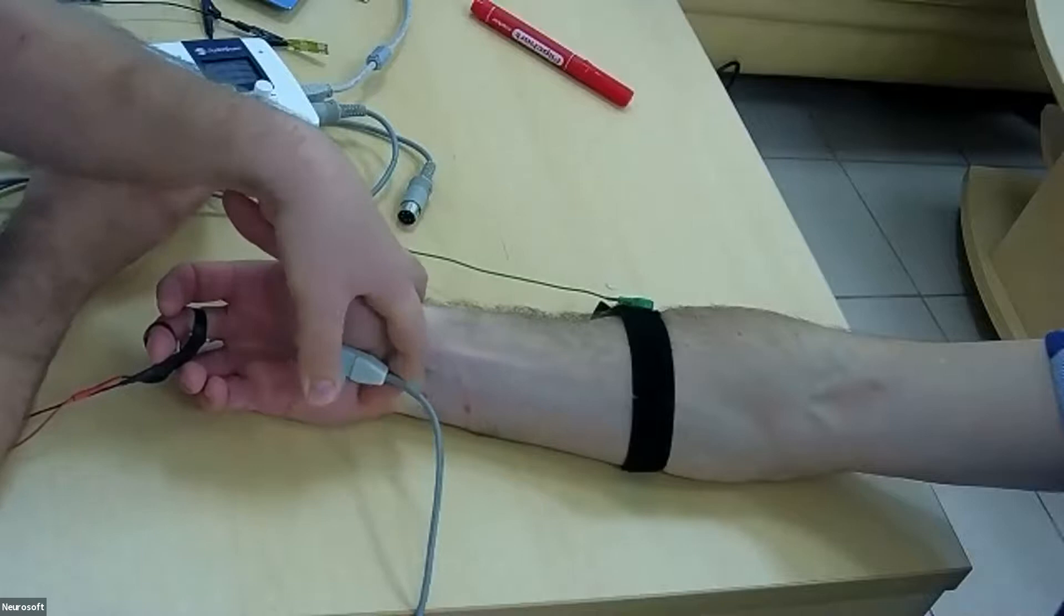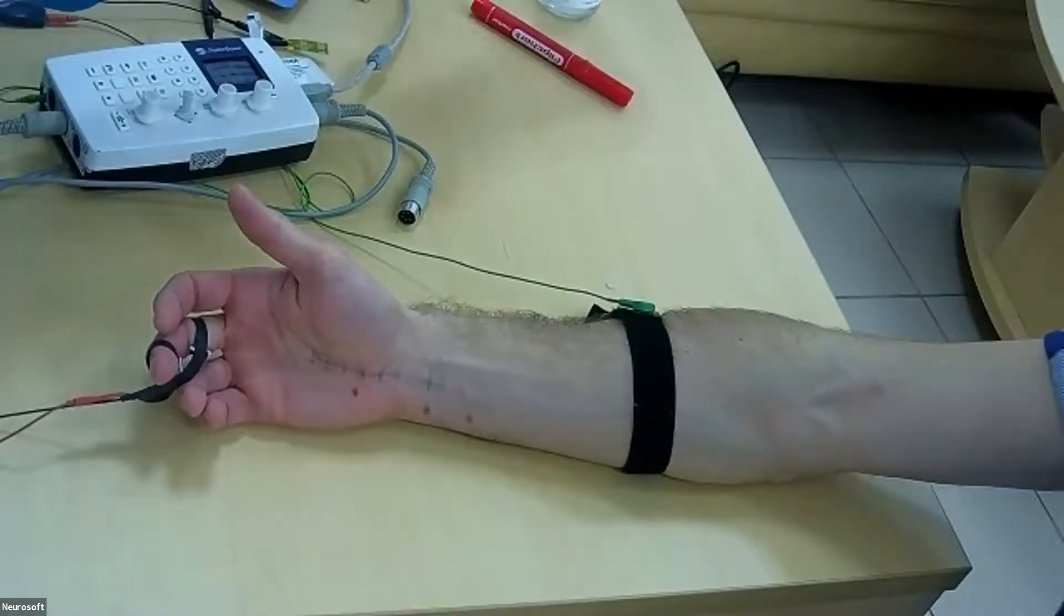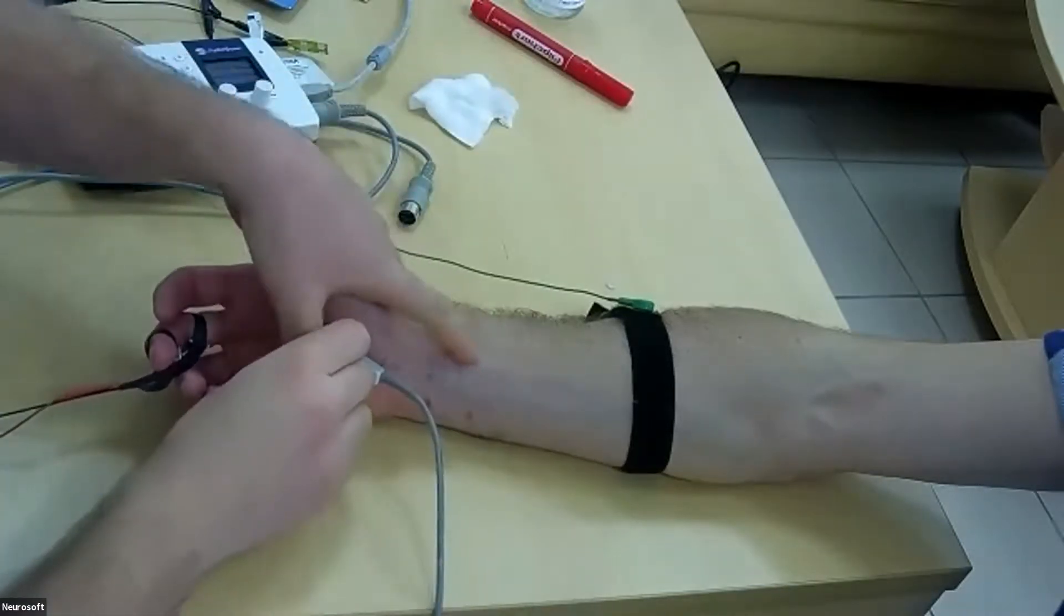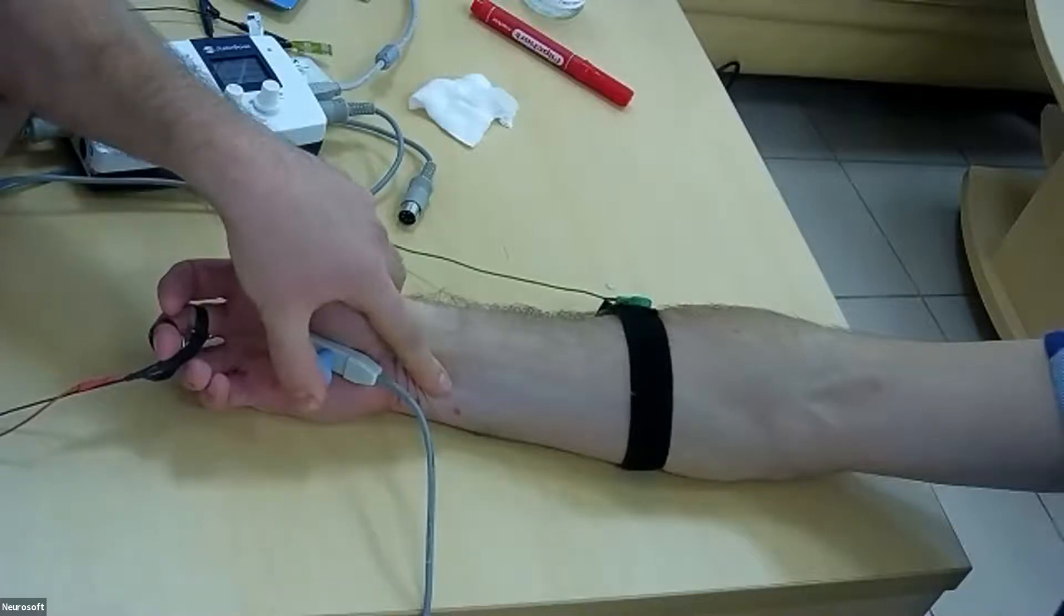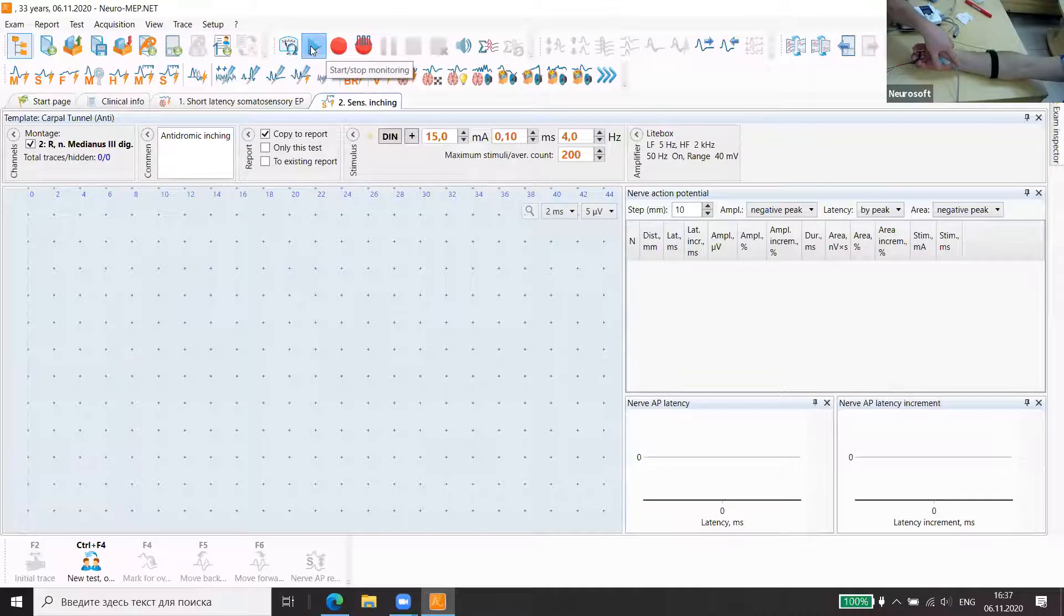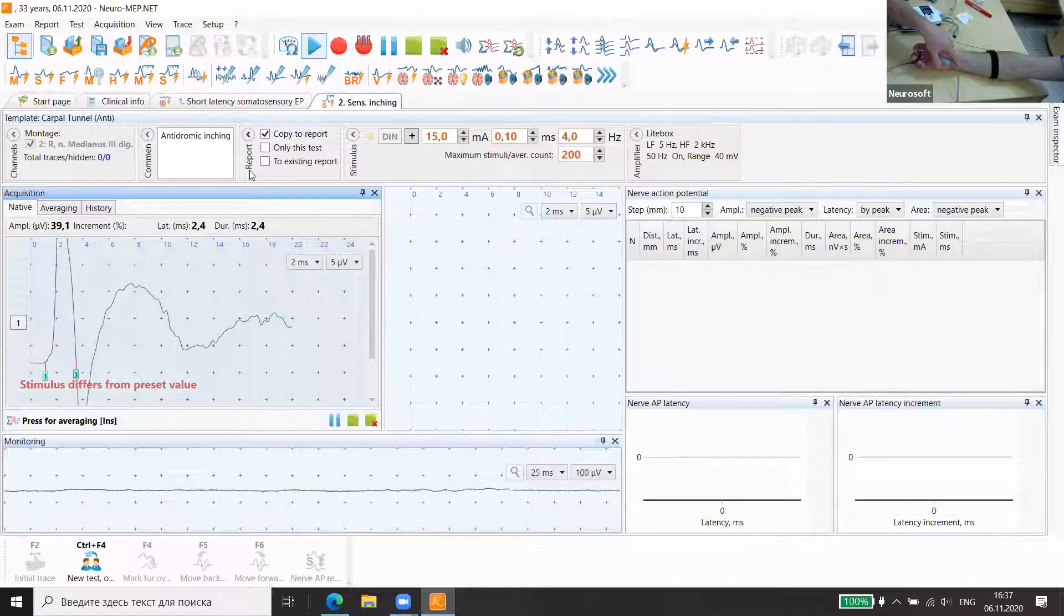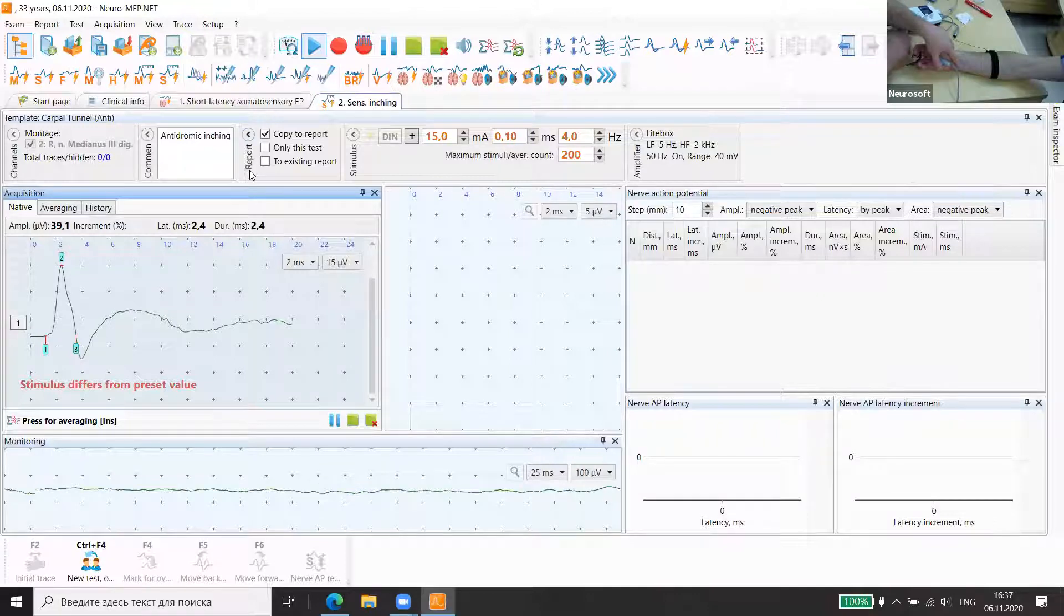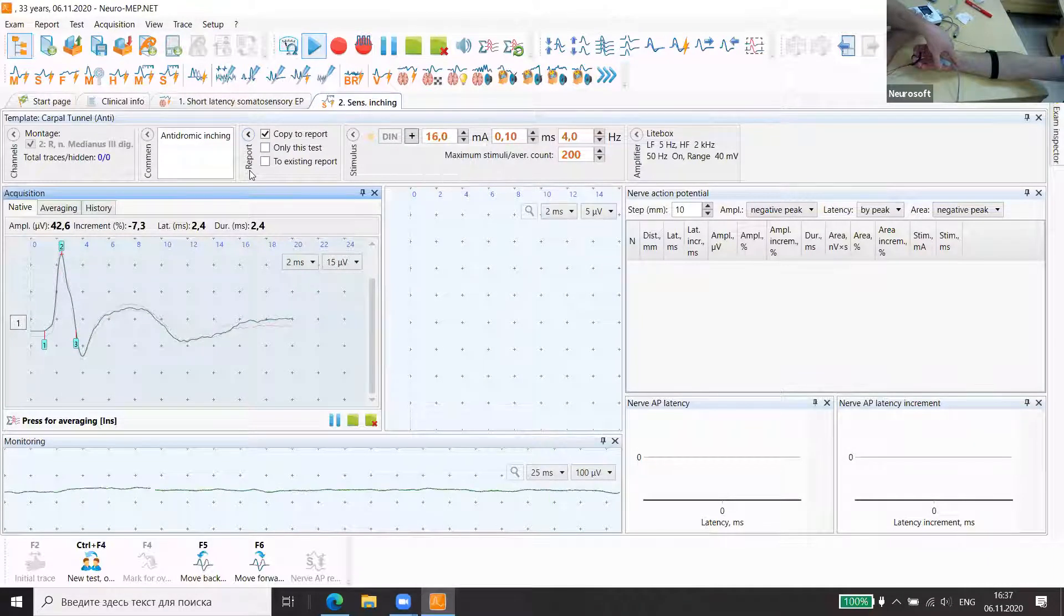We need to get a good answer. I wet the stimulation electrode. The screen demonstration is not activated. Sorry. You can see I gradually increased intensity. Now it was about, we have a very good curve line, so we can start stimulation. We have a good high amplitude peak. We can increase the intensity of stimulation some more. It's already with artifact.